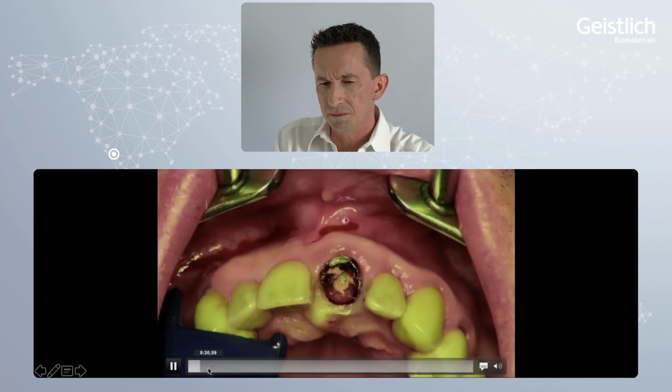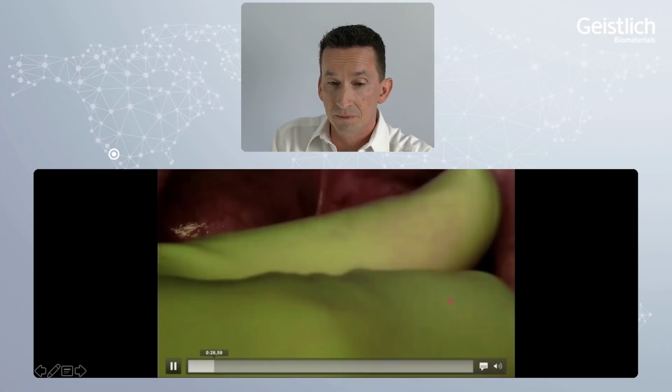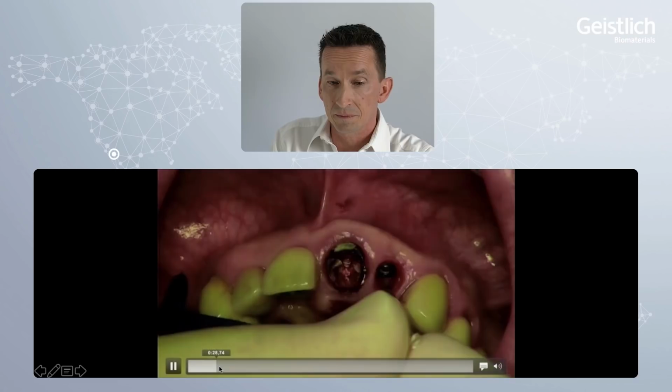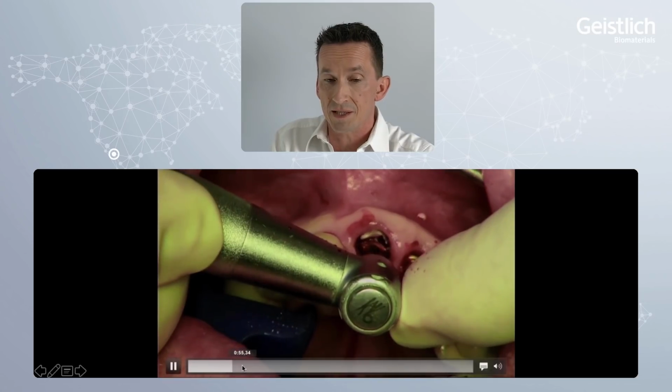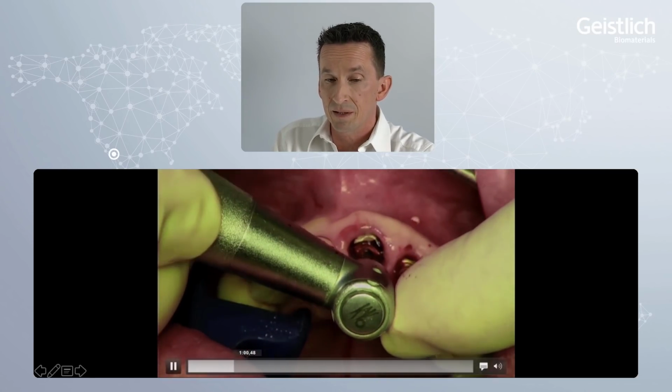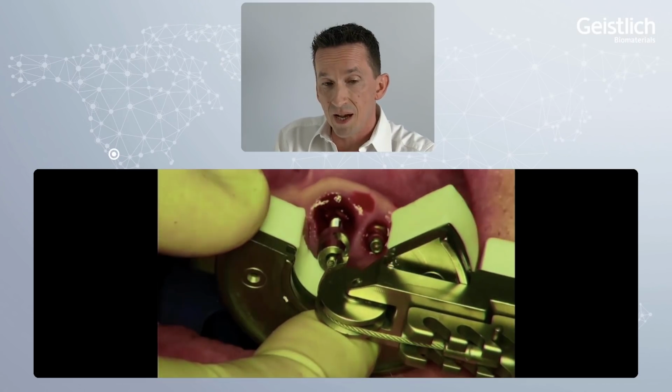We started to remove the root. This is how we remove the root with a vertical extraction system, as you see here. Take your time for that.